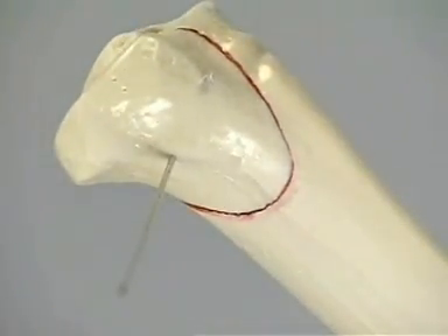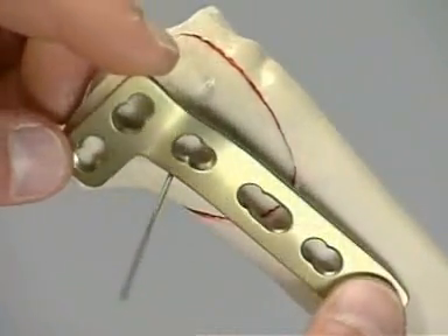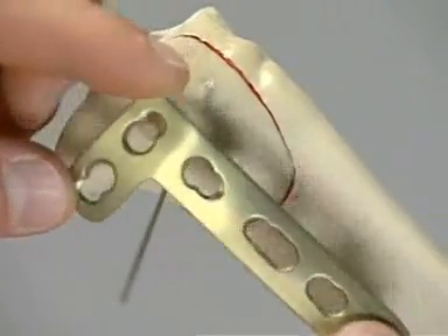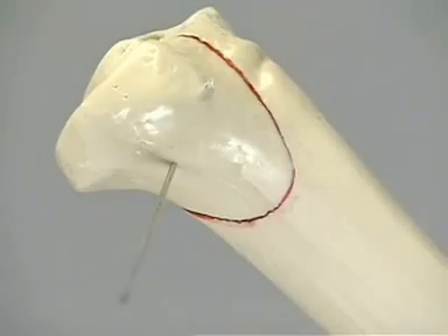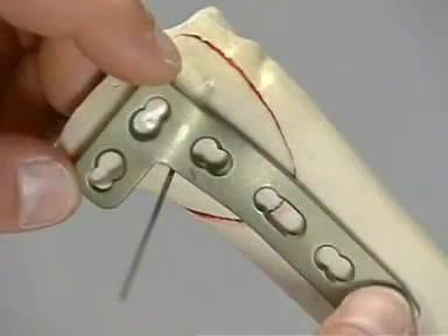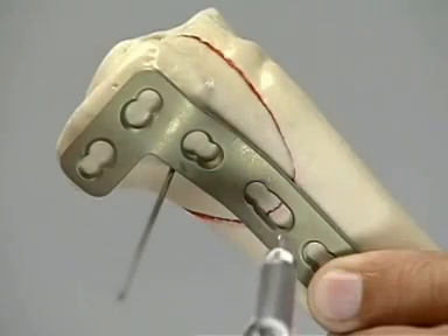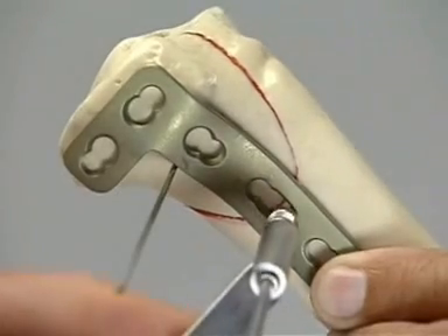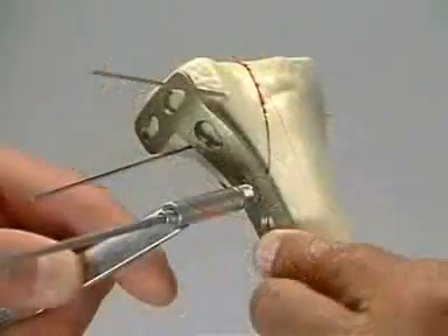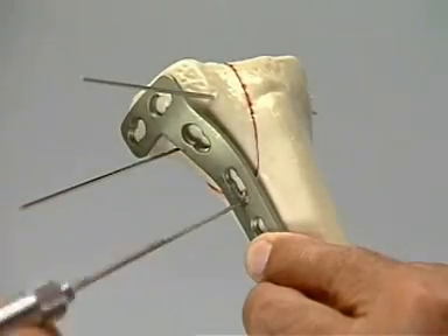The forceps is removed. A pre-contoured L-plate is used as a buttress plate in this type B1 tibial plateau fracture; however, it may need additional contouring to the bone. Otherwise, it could either fail to buttress or it could cause a deformity when secured to the bone. Once the plate fits the contour of the bone exactly, it is securely fixed. It is best to start the fixation on the diaphysial side using the elongated hole, which allows some fine-tuning of the plate position. The plate is fixed to the bone with the screw in the neutral position in the usual manner.